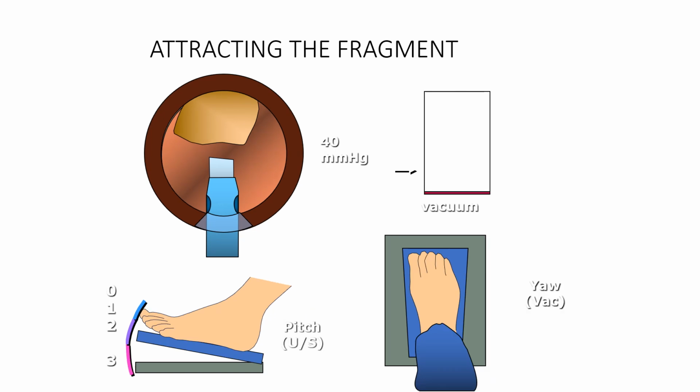As the surgeon goes into foot switch position 1, the irrigation solenoid opens up and there is irrigation pressure inside the eye. There is still no flow as there is no aspiration happening. Hence, there is just the irrigation pressure. There is still no vacuum generated inside the tip or tubing as there is no occlusion. That is, the phaco tip is not occluded.